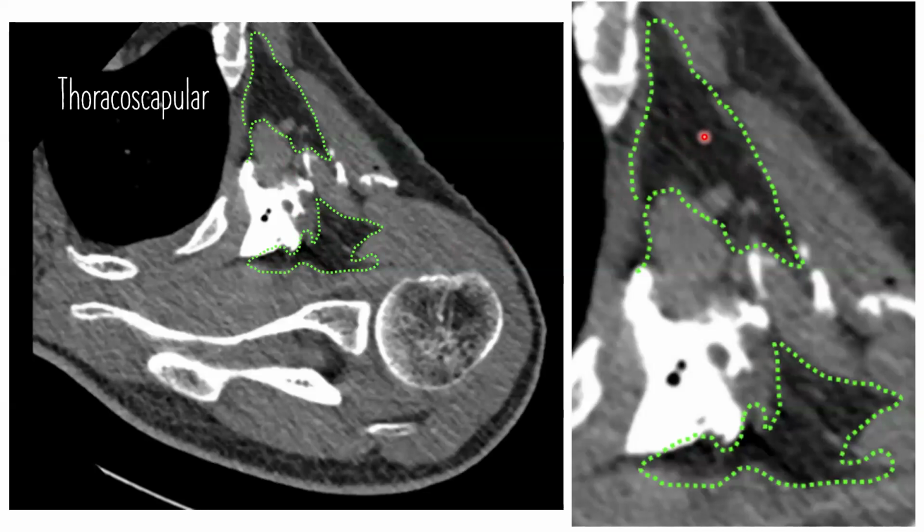This is all fat and the connective tissue here, where you can see that local anesthetic is now trying to go into this space. But since this is a continuous catheter, we inject around 5 to 7 ml in the for the postoperative pain or maybe the infusions. Now, if you inject around 30 to 40 ml of local, it's going to go into this space and probably into this space. And this space is the one which leads to inadequate blocks.